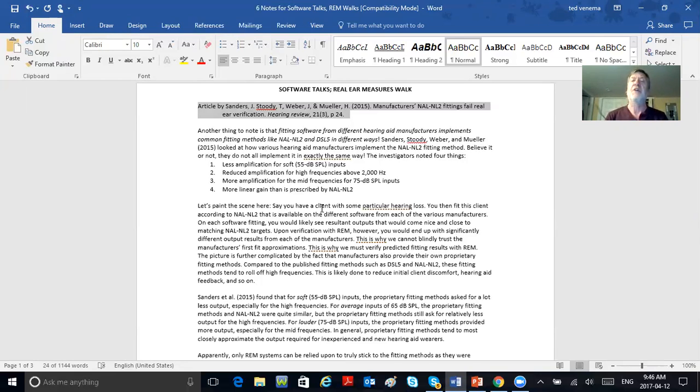And I'm going to read to you exactly an excerpt from my book, Compression for Clinicians, 3rd edition. You don't have this one yet. You've got the 2nd, so it's not in there. But check this out. Another thing to note is that fitting software from different hearing aid manufacturers implements common fitting methods like NAL2 and DSL5 in different ways. Now read that again. Fitting software from the various manufacturers implements common fitting methods in different ways.